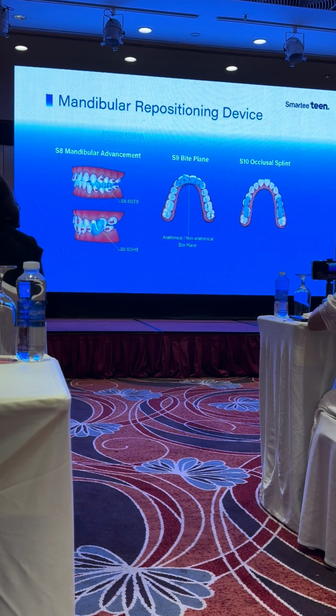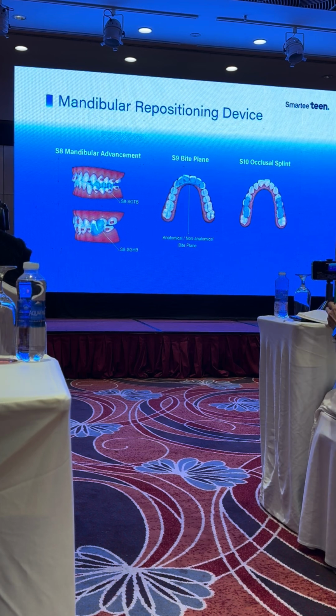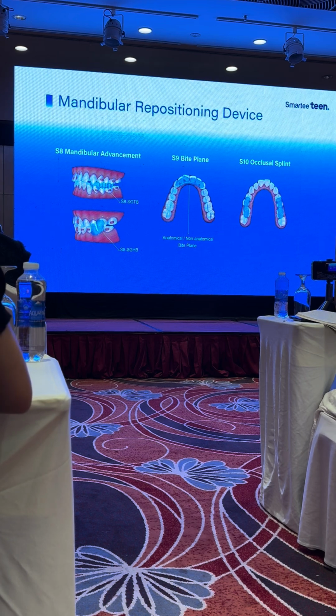This is one situation. And another is the retrograde, with the concave facial cases, meaning the class 3 cases.